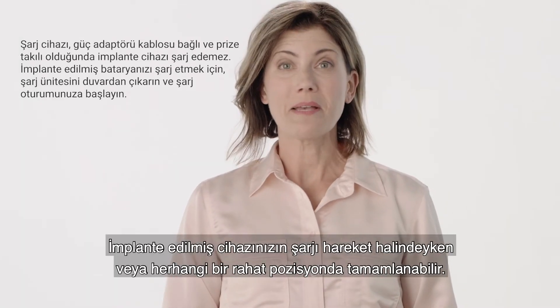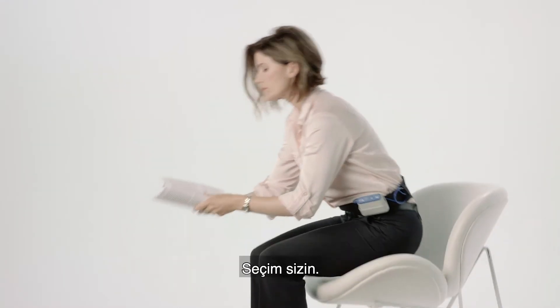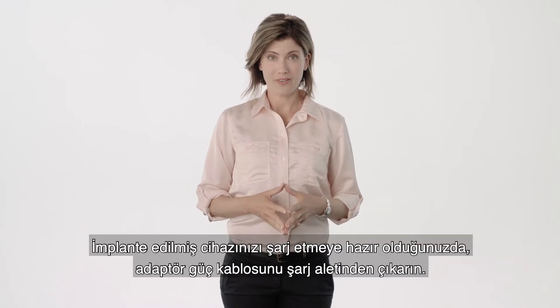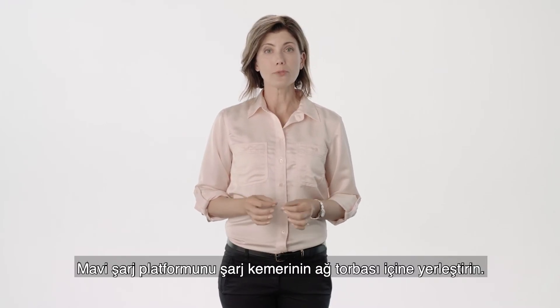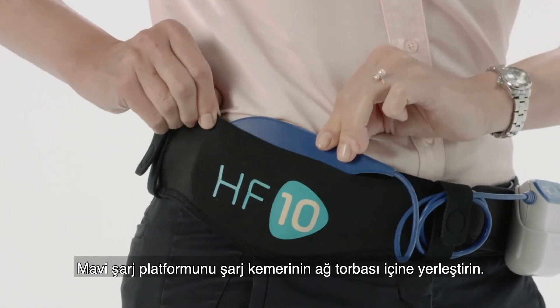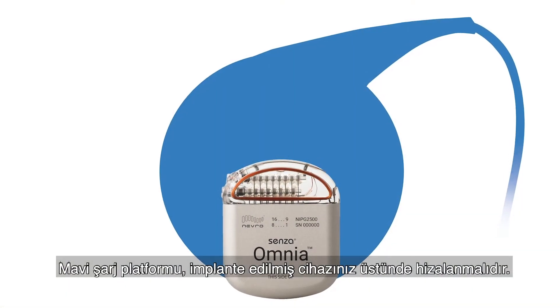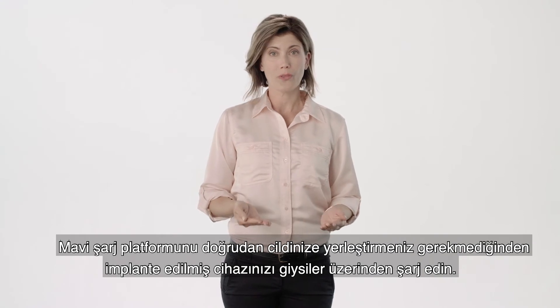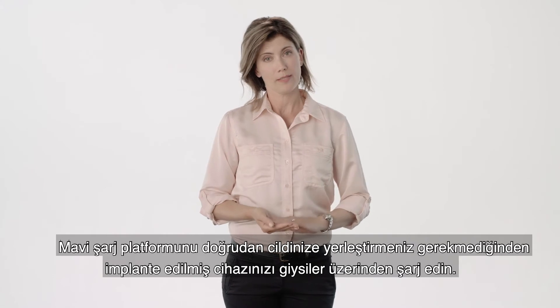Charging your implanted device may be completed while on the go or in any comfortable position — the choice is yours. When you are ready to charge your implanted device, remove the adapter power cord from the charger and place the blue charging pad inside the mesh pouch of the charging belt. The blue charging pad should be aligned over your implanted device. Charge your implanted device over clothing, as it is not necessary to place the blue charging pad directly onto your skin.